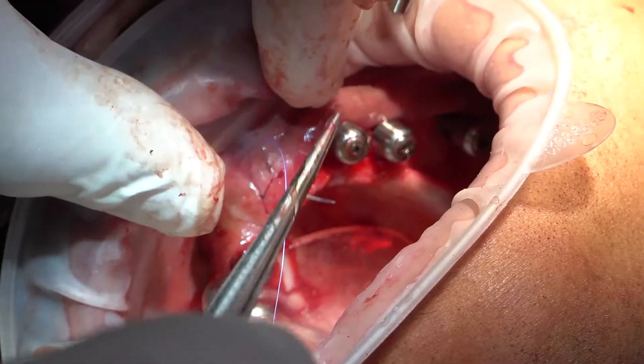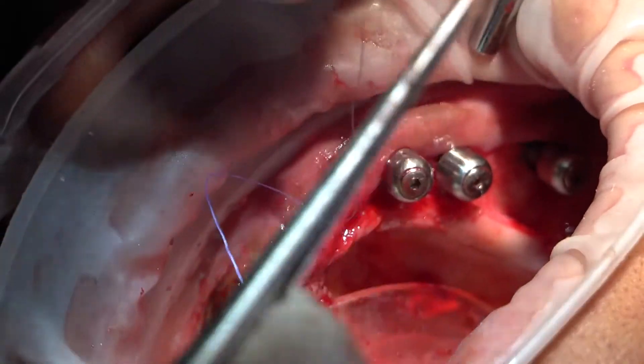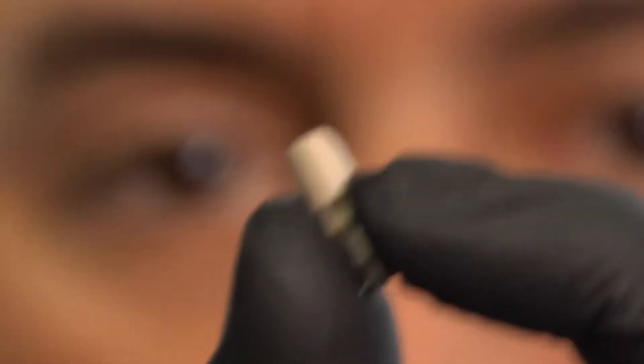The second scan body is the healing abutment. If the doctor decides to go ahead and start suturing and doesn't have to remove anything from the mouth, he's just going to place this short scan body on top of the healing abutment, tie it, and now we can scan. We do this every day and we are always improving our techniques.